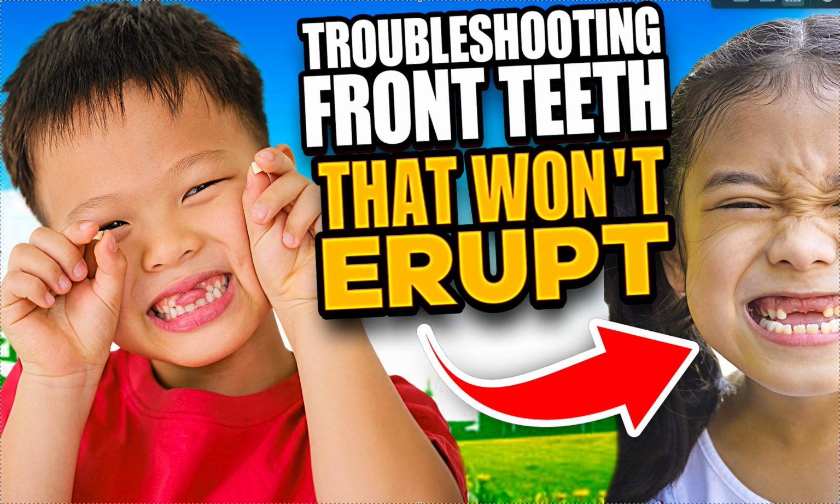The main thing is that you're going to have sequential x-rays, panoramic, or ideally, if not, PAs every 6 months showing progress. If the patient is within the realms of eruption, these teeth are supposed to come in at 8 to 8.5. So unless the patient is like 10 or 12, then I would start getting worried.